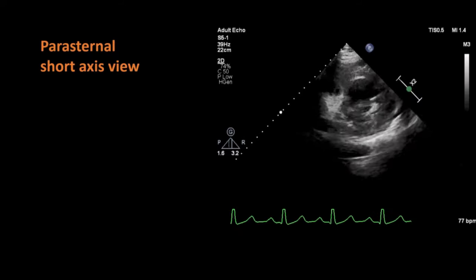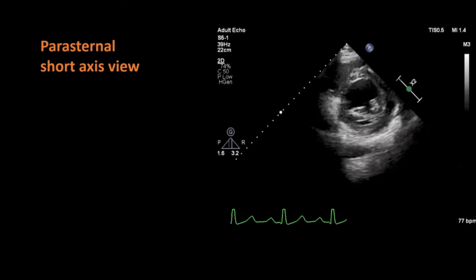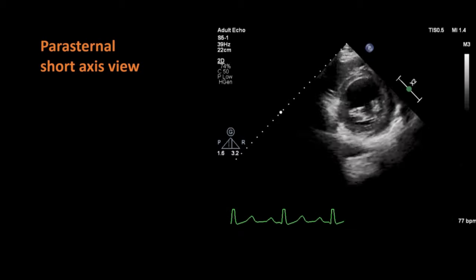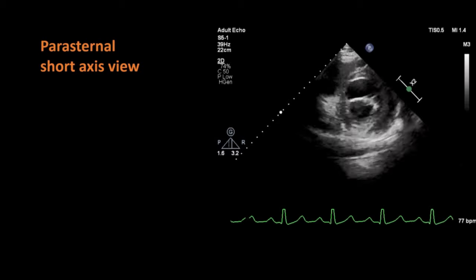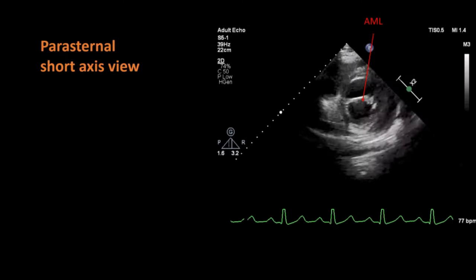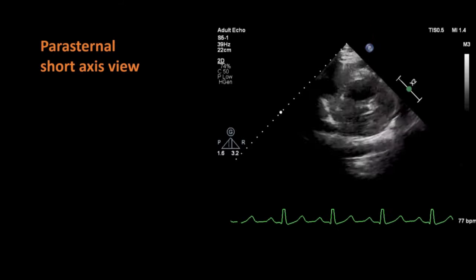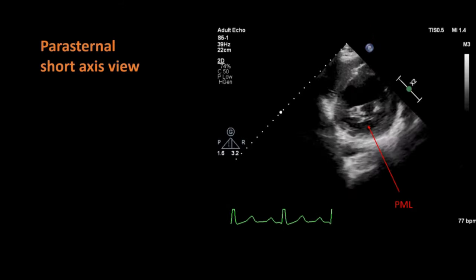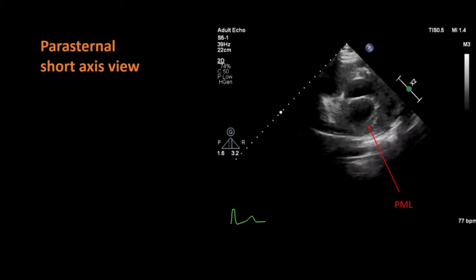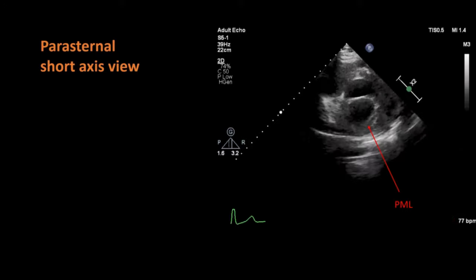If you tilt the probe further towards the apex, you will be able to get the short axis view of the heart at the level of the mitral valve. In this view, you can see both leaflets of the mitral valve clearly: the anterior mitral leaflet and the posterior mitral leaflet. If the mitral valve is stenosed, you can calculate the area of the mitral valve opening in this view.